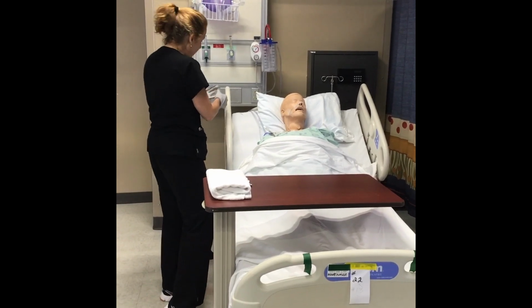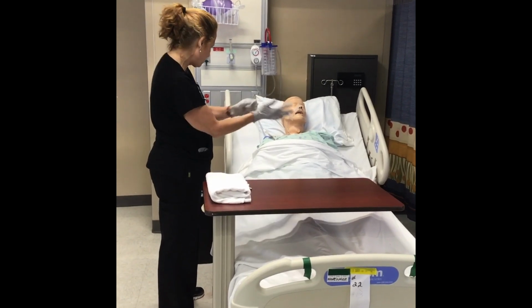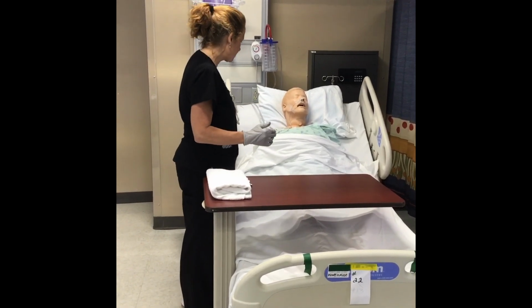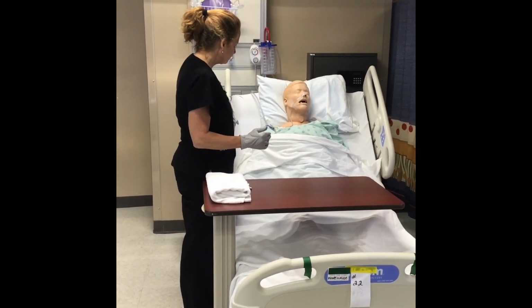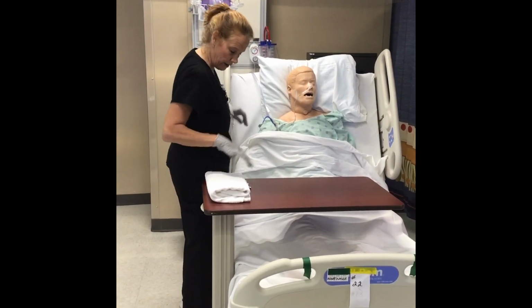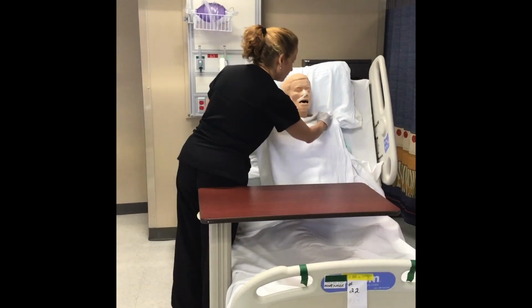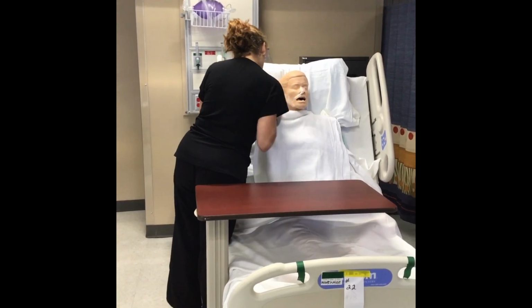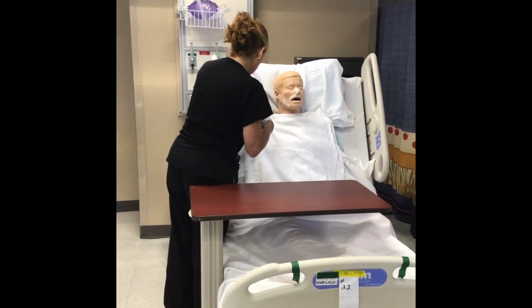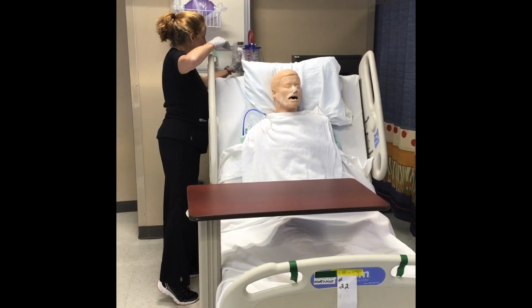Okay, so remember when I put the NG tube in, I put you up to that high Fowler's position, the 90-degree angle? We're going to do that again, okay? Okay. Let me know if you have any discomfort while the process is going on. How's that feel? Good? That's okay. Okay, now I'm going to put this towel across your chest. We're going to tuck it here, and right underneath here. Okay. All right, I'm going to go turn the suction off. So the suction is off.